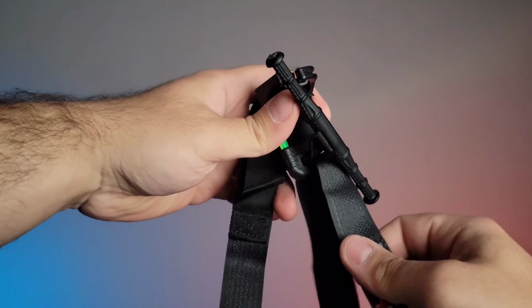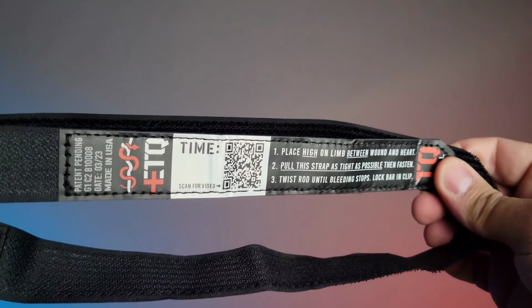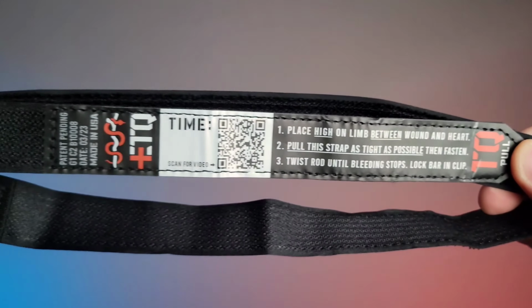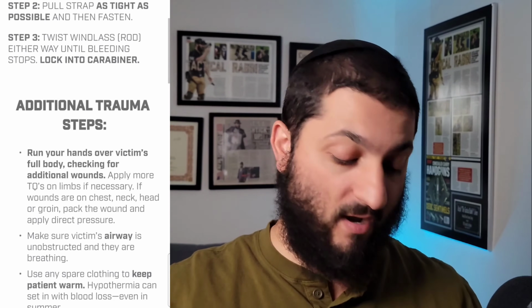Now, what's very cool about this tourniquet is on the back of the tourniquet, they actually have a QR code that anyone would be able to scan, and it'll load up a video of how to apply a tourniquet. Now, if you don't see the problem already, there's a few variables that need to be considered when you make that design. The first thing will be, how good is your service in that area to load up the video as fast as possible? So you can't assume that your internet's going to be good enough. The second thing is that the video is over a minute long.